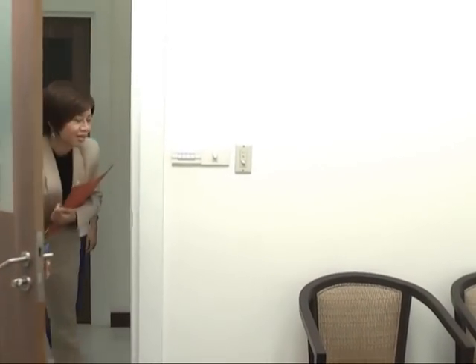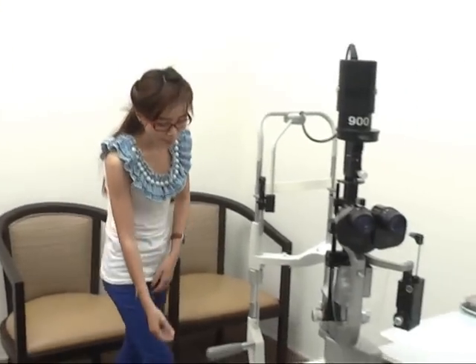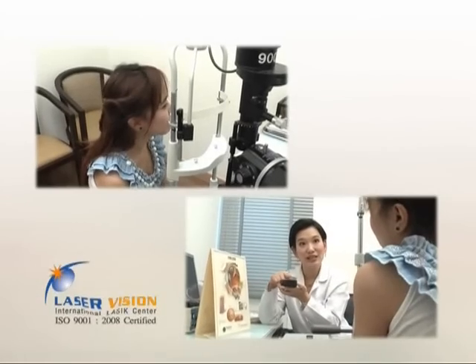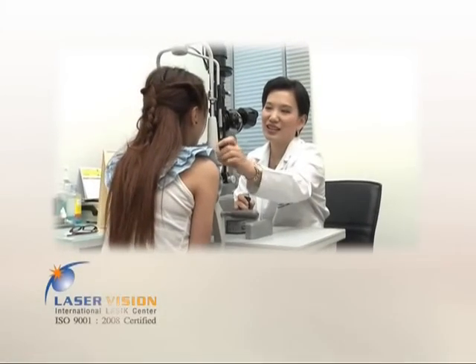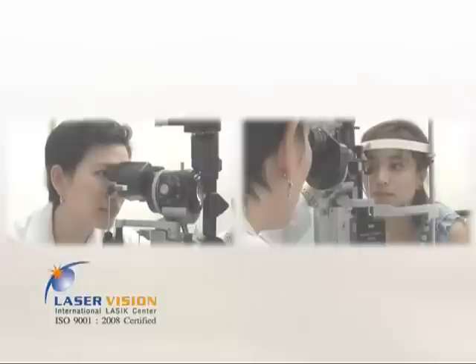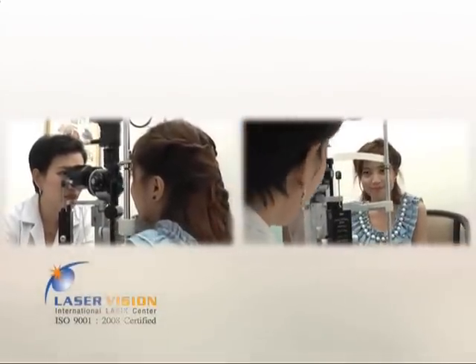We also have the NV LASIK. These are very different in detail, but both of them are for the presbyopia. And these are the types and subtypes of the LASIK that can be classified shortly. However, all patients are recommended to have an evaluation from refractive surgery specialists. Each person's eye is different, and also the reaction of the laser on each person's eye tissue. Pre-surgical evaluation is necessary so that the right LASIK technology could be chosen for you.